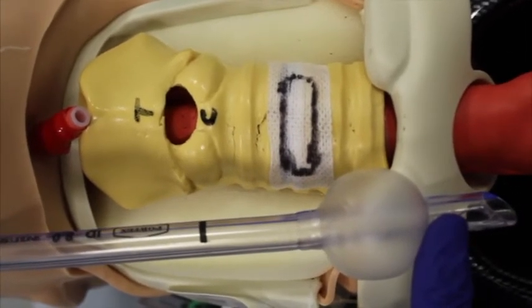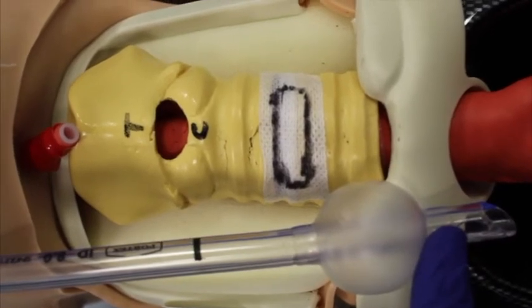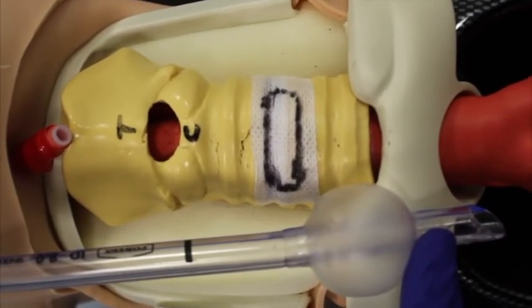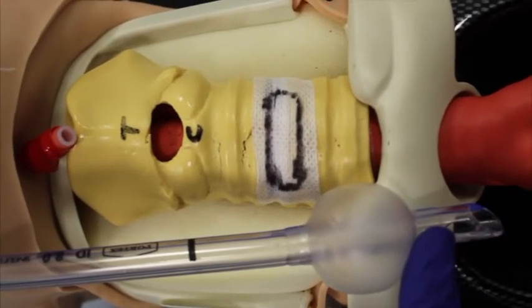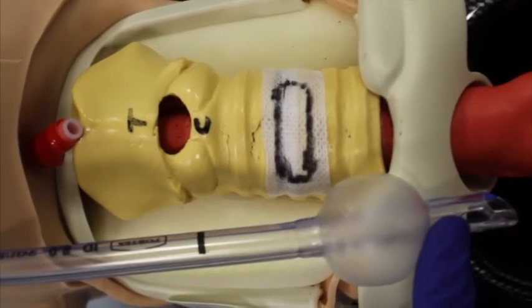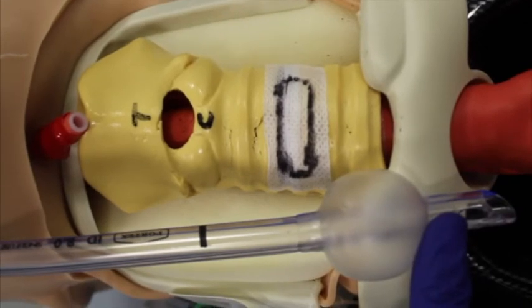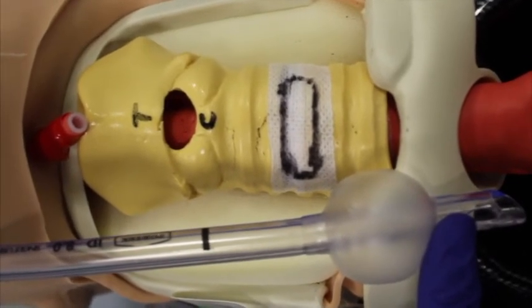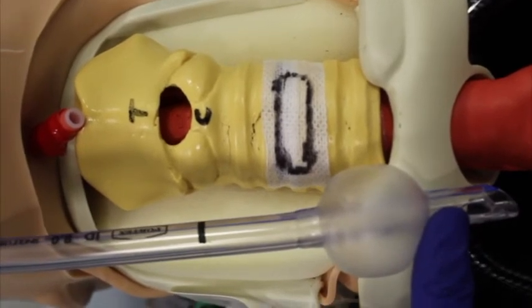The pressure of the lungs should be held by the cuff, and no aerosol should be generated. As long as this is felt clinically to be the case, then completion removal of the ring with careful preservation of the cuff should be continued, again with low frequency, low pressure ventilation.